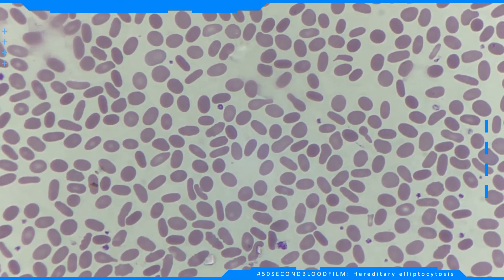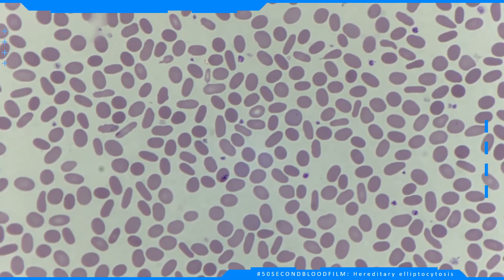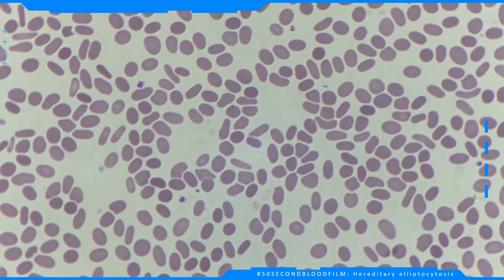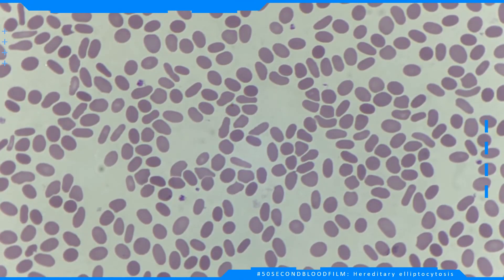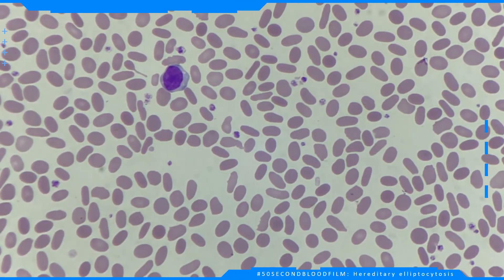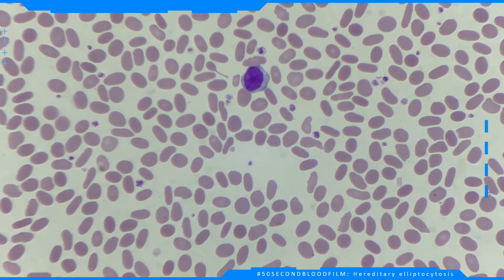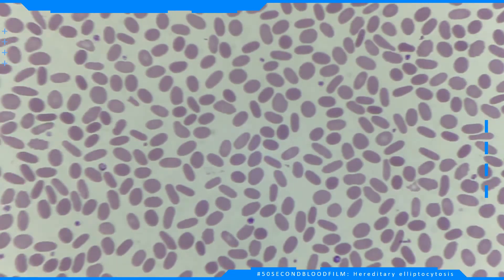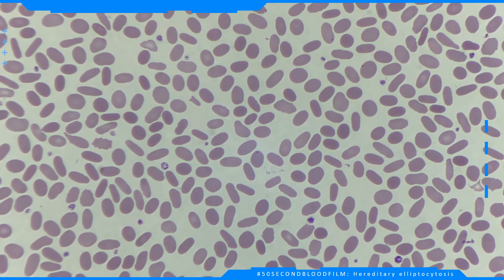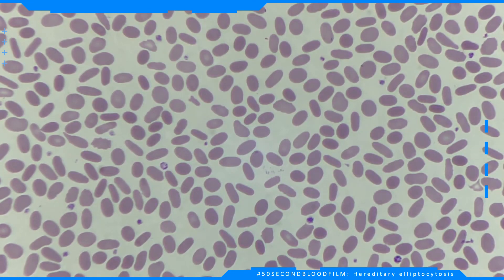In many cases the condition is asymptomatic, however some patients may have severe hemolytic anemia. The red cells in hereditary elliptocytosis are normally hemoglobinized, whereas in iron deficiency the characteristic features include microcytic hypochromic cells.